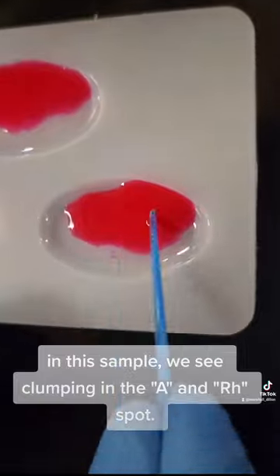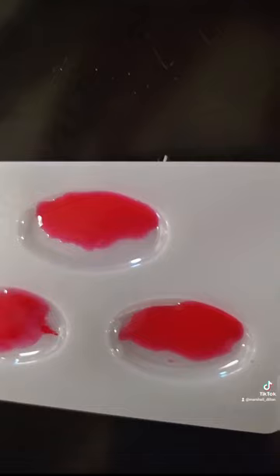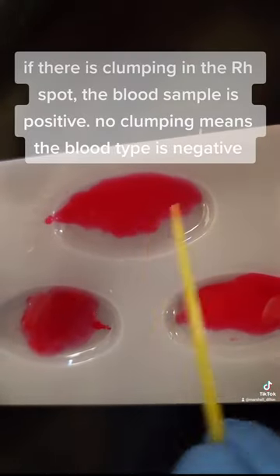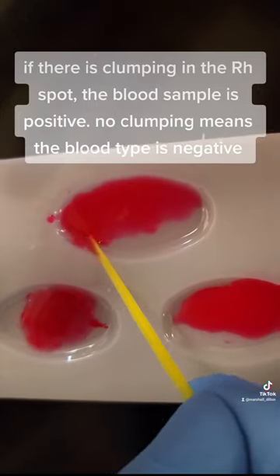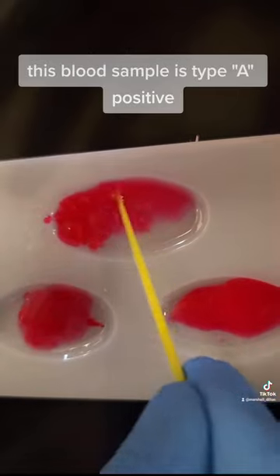In this sample, we see clumping in the A and RH spot. If there is clumping in the RH spot, the blood sample is positive. No clumping means the blood type is negative. This blood sample is type A positive.